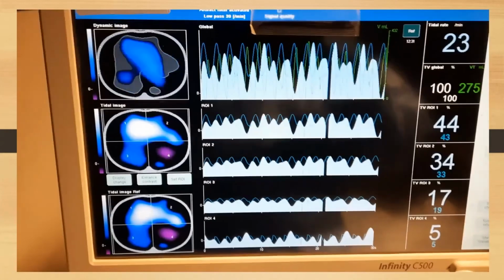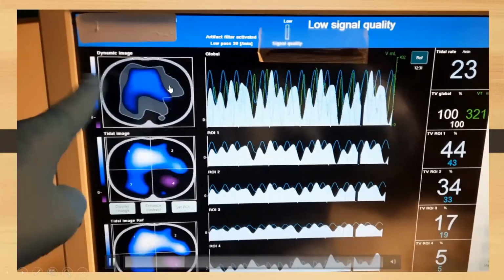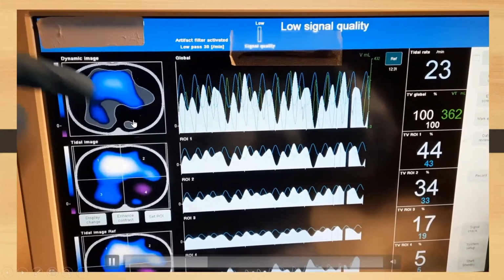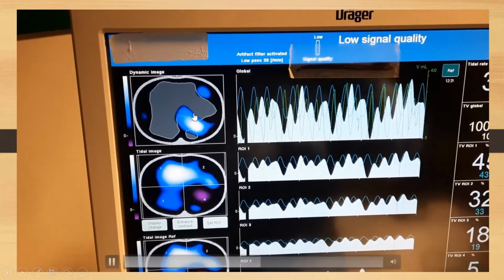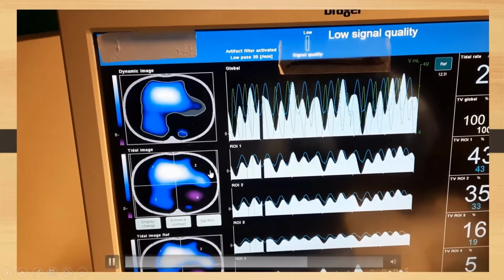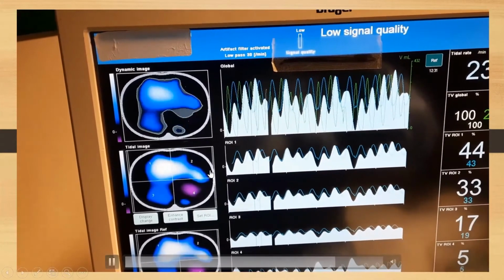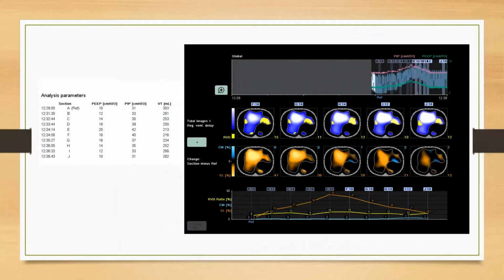You see over here that there's a possibility of some ventilation occurring here. So it's going sometimes down here. So we decided to try APRV, but before the doctor wanted to try higher PEEP, so we did a PEEP trial. And this is the PEEP trial here.